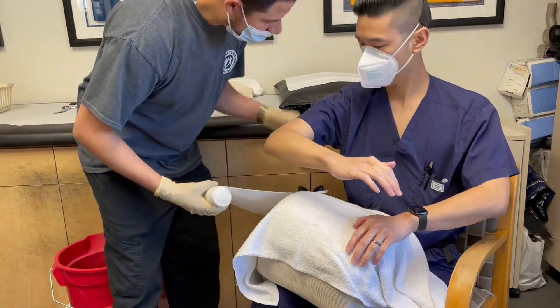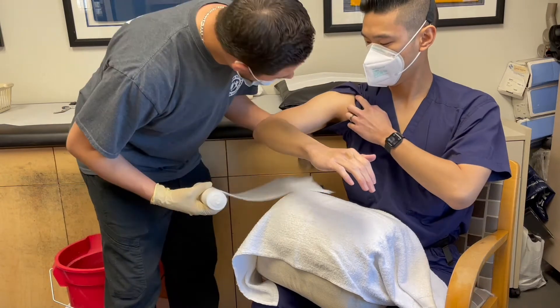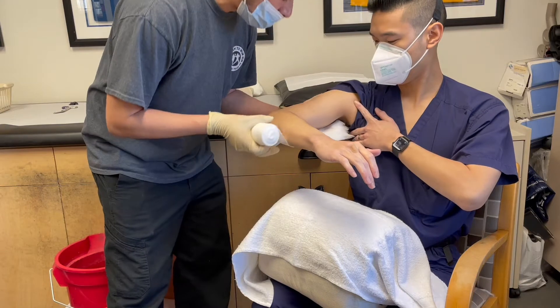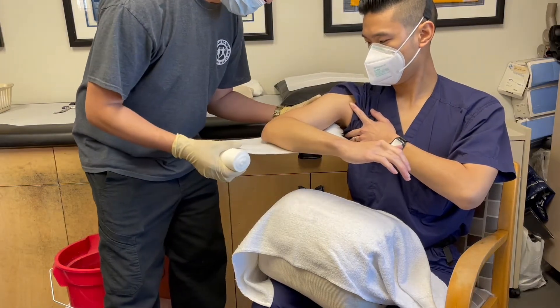We want to have the patient flex the elbow to 90 degrees. Then you measure approximately two finger breadths from the axilla, wrap around the elbow, and measure up to the AC joint.